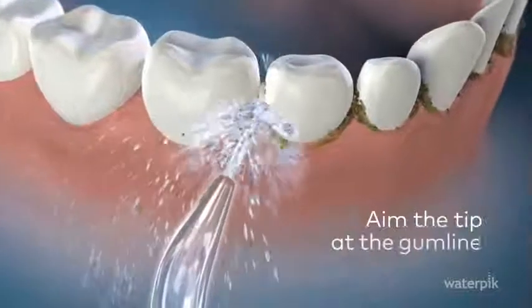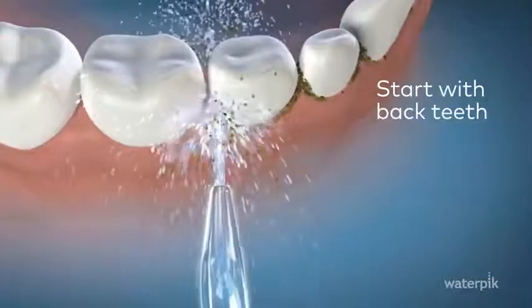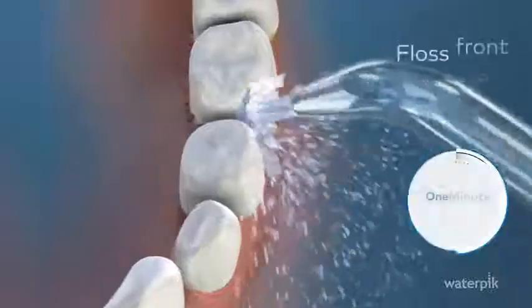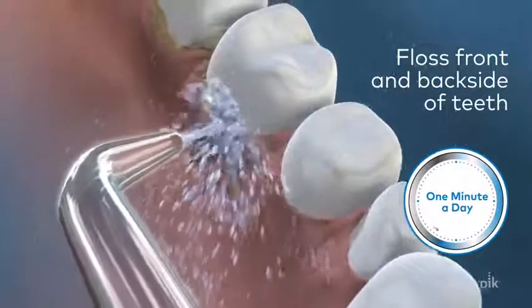Aim the tip at the gum line. For best results, start with your back teeth. Move along gum line, pausing briefly between teeth. Floss front and back side of teeth for 1 minute a day.